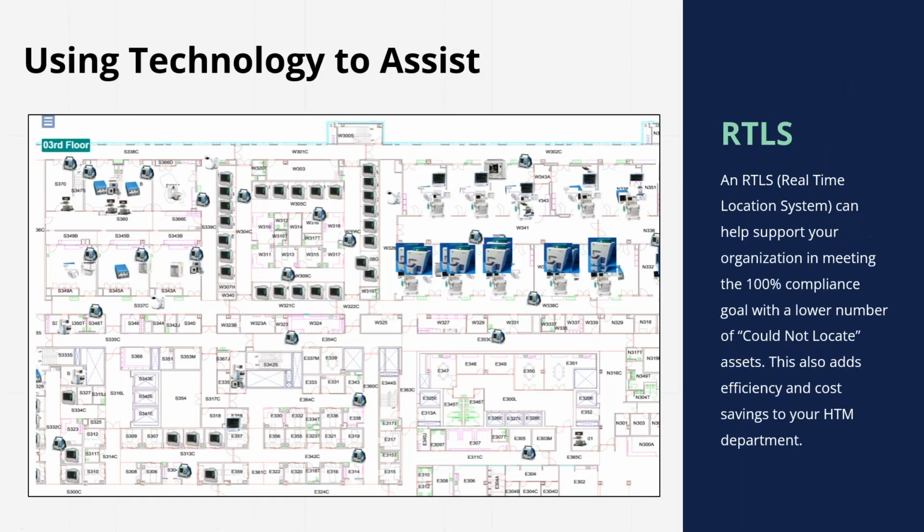So here's just a visualization. If you can see where your assets are located, here's a visualization of what that might look like, potentially in an RTLS system or a CMMS system if you do an integration. That's what we have, an integration to an RTLS.